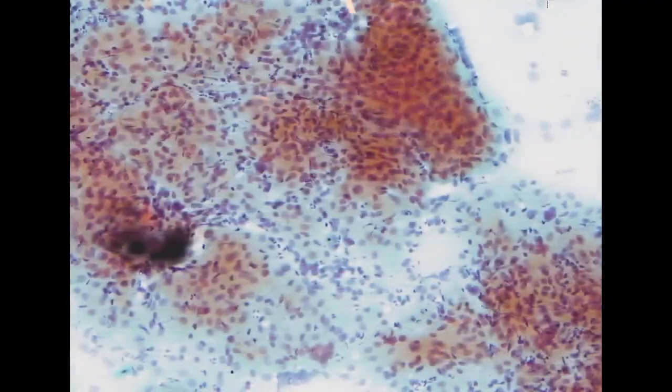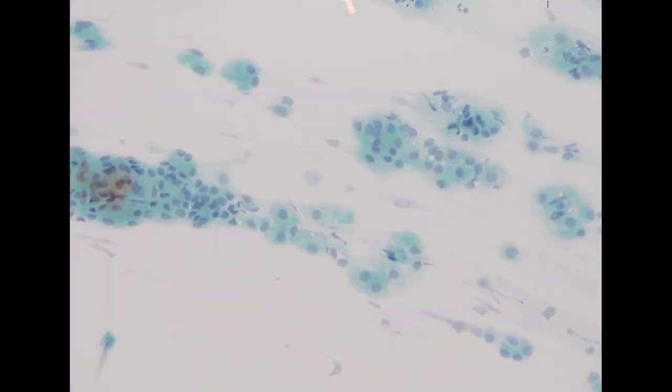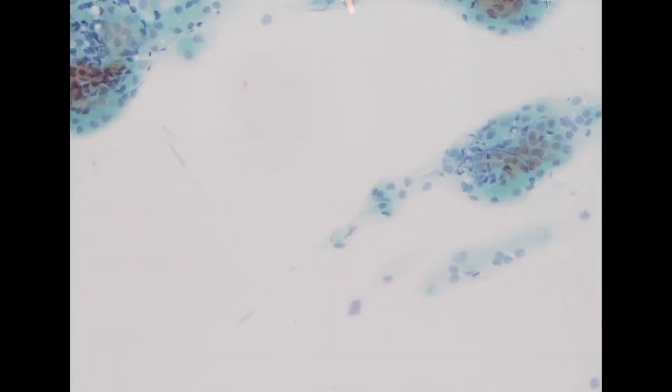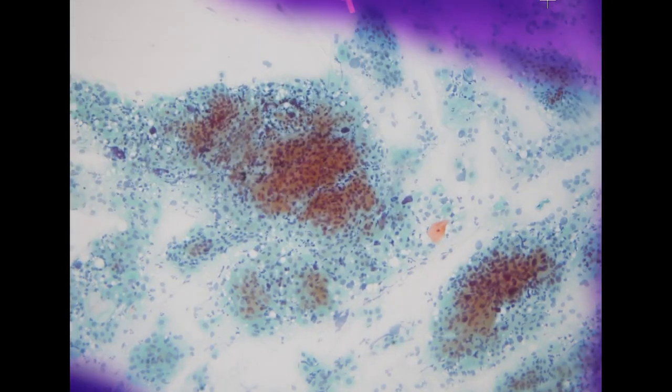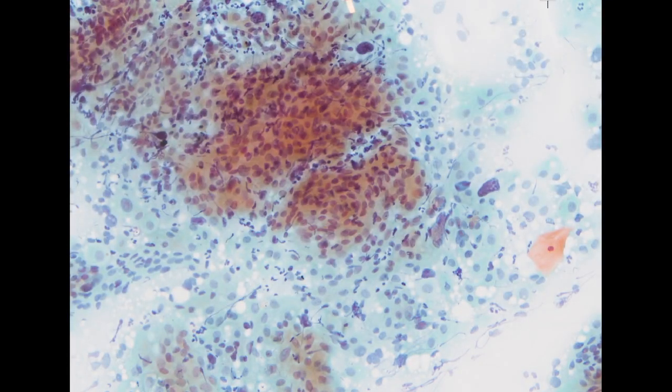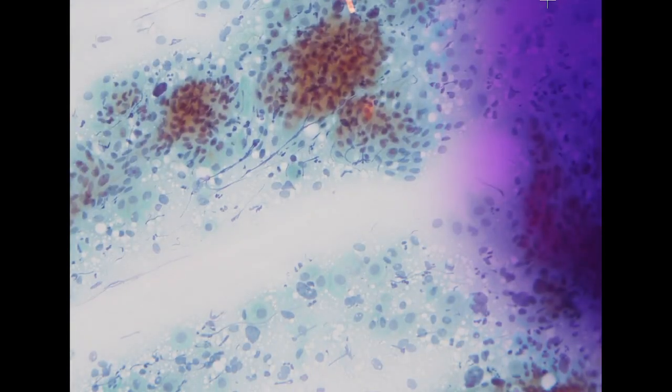So when we see a specimen like this, be aware, do not overdiagnose this as HSIL. In the atrophy background, I think we should be more conservative. For these, at most, you can call ASCUS, but do not rush into the HSIL diagnosis, especially since the patient is already 67 years old. And in her requisition sheet, the clinician already put a note that the patient has already received a hysterectomy.